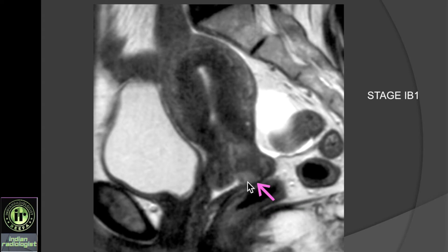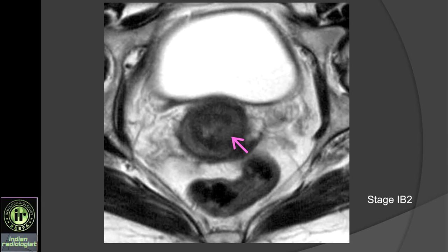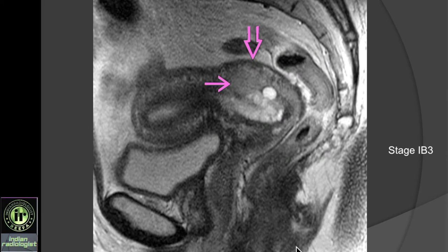Here we have an example of a tiny T2 hyperintense lesion in the ectocervix. If we measure it, it's going to be small — this is the tumor and this is going to be stage 1b1 disease. In another case, we see a tumor to the left of the midline involving the endocervix. We have lost the internal junctional zone rim and it involves the cervical stroma, but the outer rim is still intact — this is stage 1b2. In another case, the tumor is causing expansion of the posterior cervical wall and it's going to be more than 4 centimeters in length — this is stage 1b3. So you have to identify the tumor, which is T2 hyperintense with restricted diffusion, and measure it to decide which stage of 1b it is.